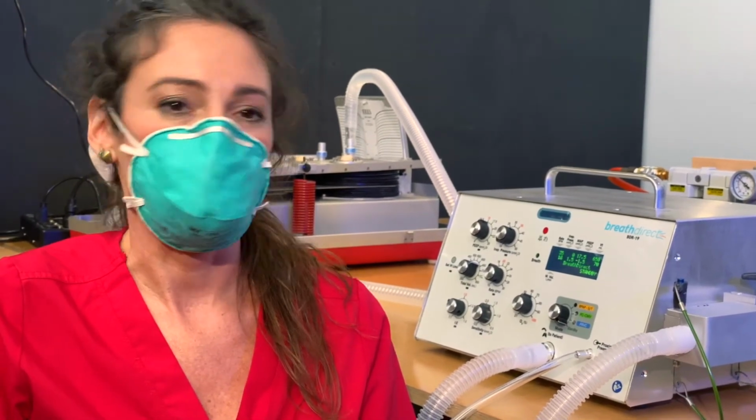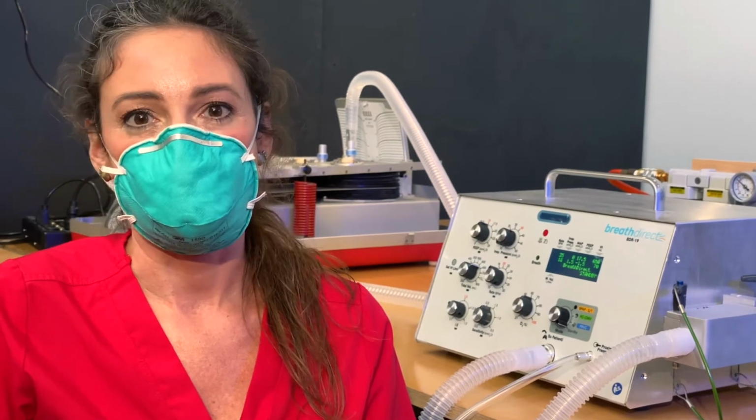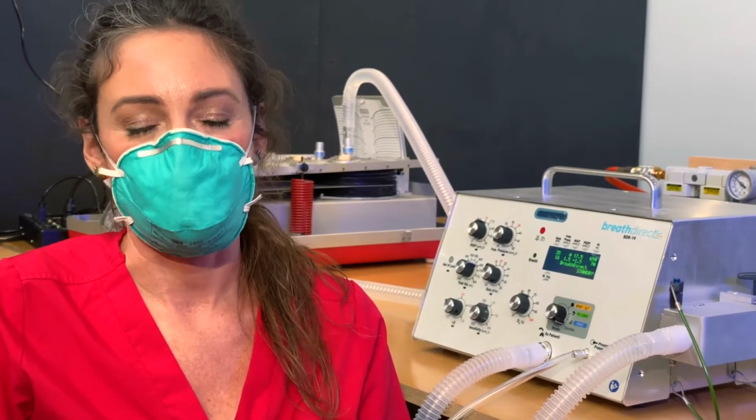The FDA requires ventilators to have an intentional action for setting the modes and changing some of the oxygen settings. Some of the newer ventilators that have touchscreens oftentimes have you go through confirmations and push extra buttons, which takes extra time. So any time that we can save and be more efficient is crucial in helping these patients live longer. The goal, the objective of the vent is really to keep it very simple.